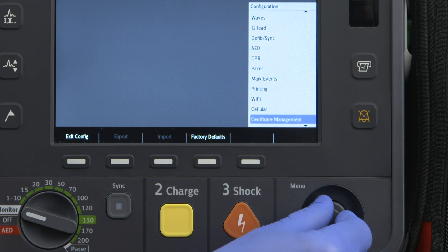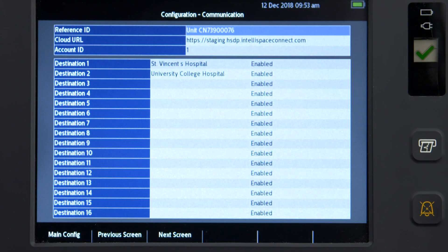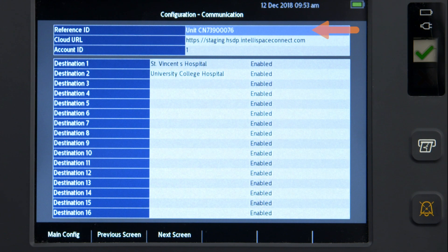Highlight and select Communication and the Configuration Communication screen opens. Here you enter the Reference ID, which may identify the Intrepid device or the vehicle to which it is assigned; the IntelliSpace Connect Cloud URL; and the Account ID, which is your six-digit Philips IntelliSpace Connect account ID. The Destination fields contain the identification of the hospital or medical facility that has access to the transmitted data. You must enable a destination to send data to that location; if no destination is specified, the data is available only to the device owner.